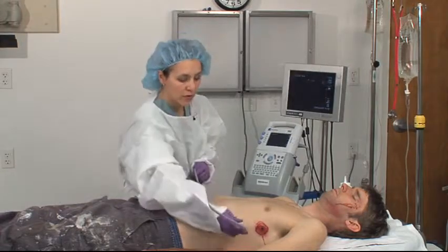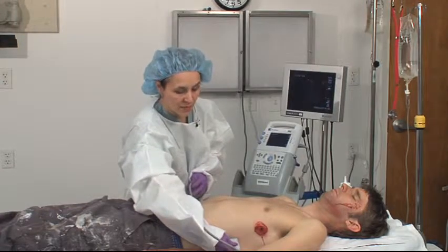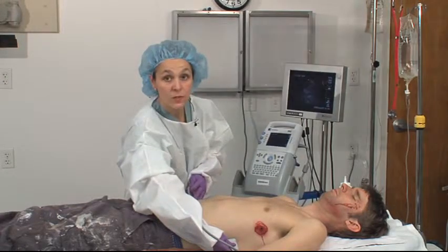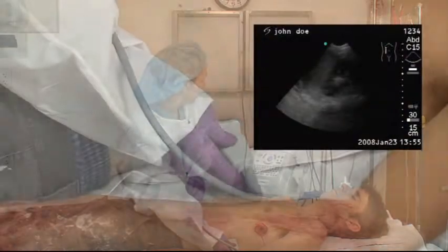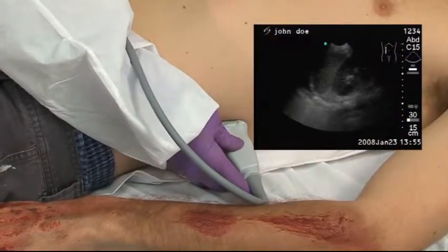The left upper quadrant, much the same at the inferior aspect of the rib cage, to find the spleen and kidney interface.